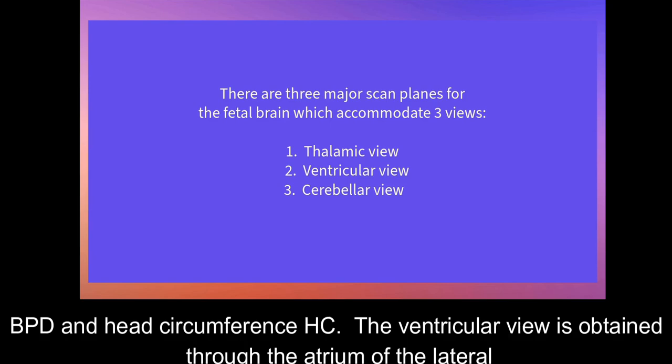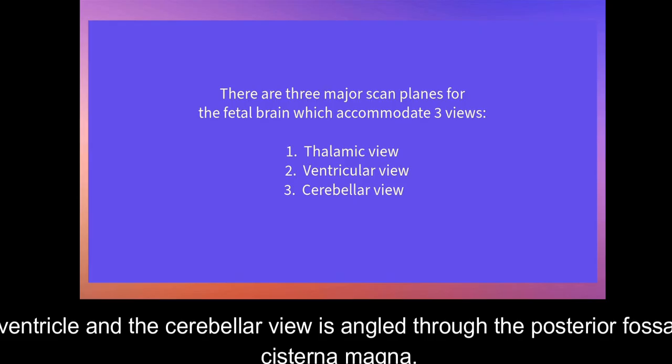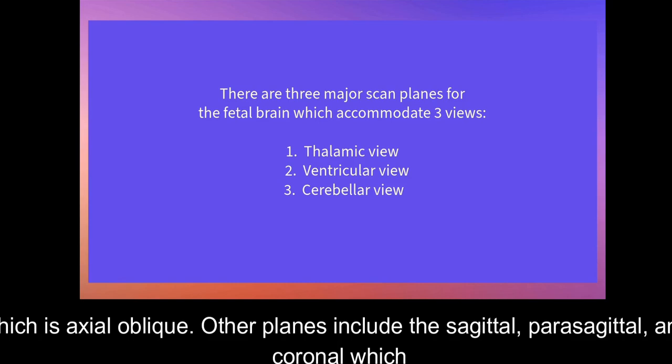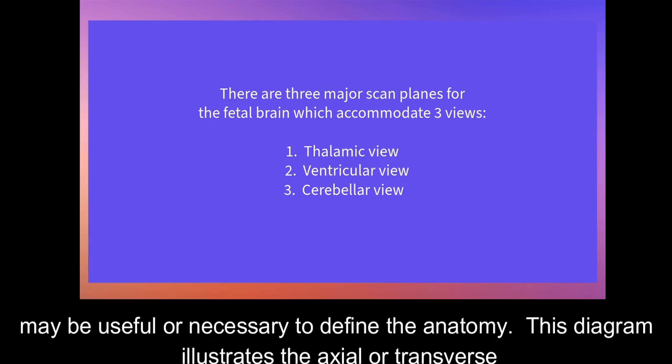The ventricular view is obtained through the atrium of the lateral ventricle, and the cerebellar view is angled through the posterior fossa, cisterna magna. All are axial, transverse views of the fetal head with the exception of the cerebellar view, which is axial oblique. Other planes include the sagittal, parasagittal, and coronal, which may be useful or necessary to define the anatomy.